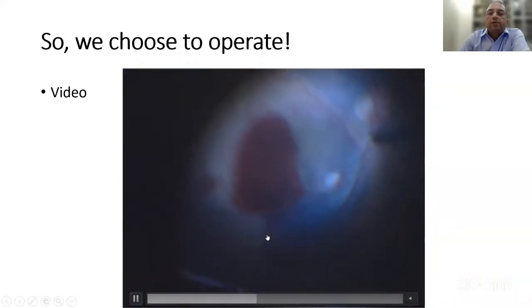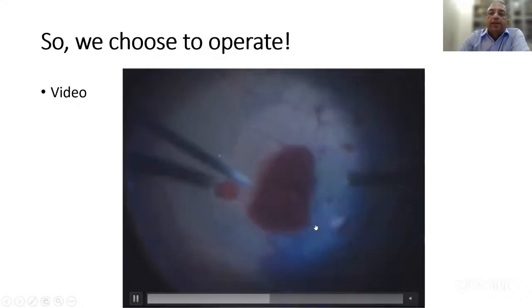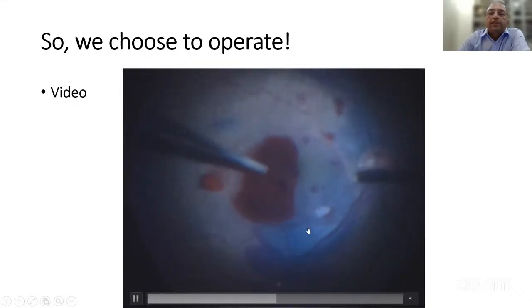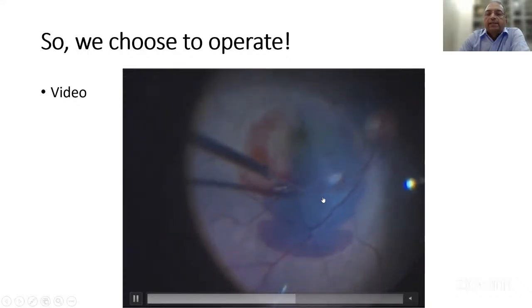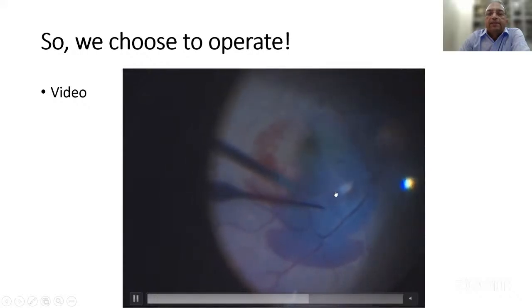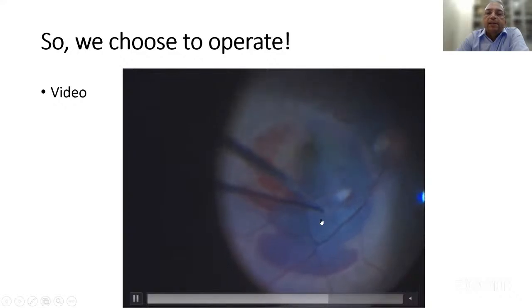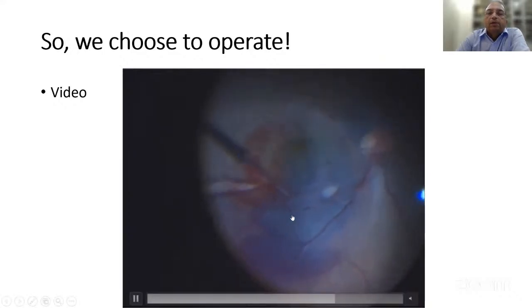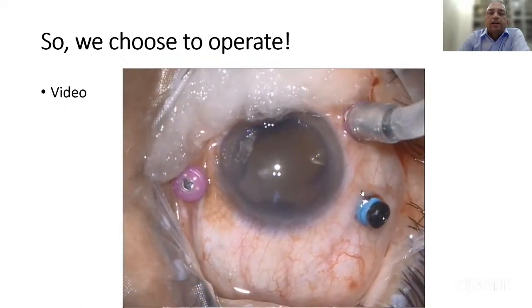Normally, what we try to do is at the intended site of subretinal injection, we make sure we peel ILM at least at that part. Now, choosing which place we should be injecting subretinal TPA, I think you should try to injure fewer nerve fiber layers, so you can't go very close to the disc. And whichever part you try to make the bleb, you have to ensure that ultimately you are injecting TPA to involve the whole amount of blood, and you can always choose your site where the maximum height of blood is there.